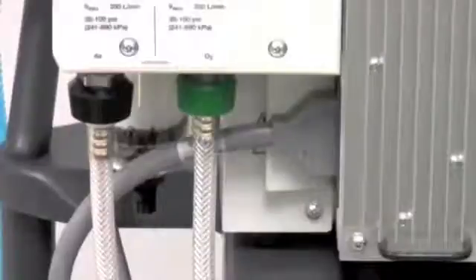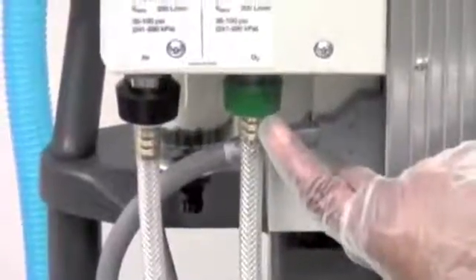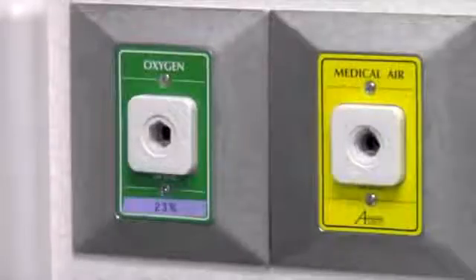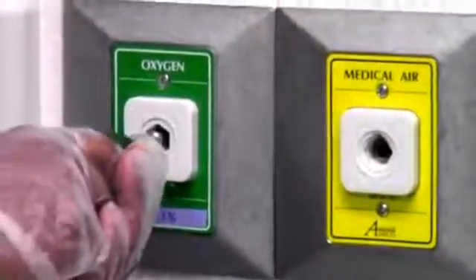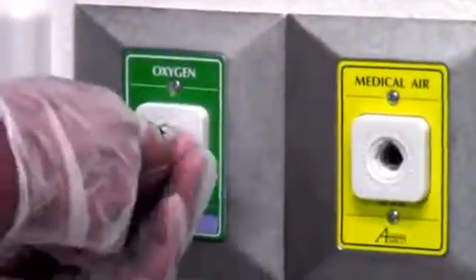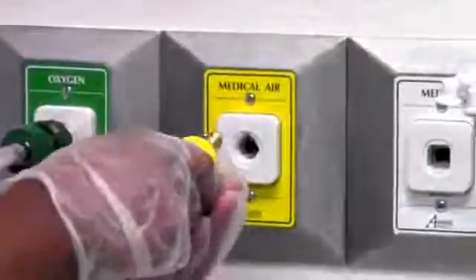You will now connect air and oxygen supplies to the ventilator. Connect the oxygen hose from the oxygen inlet connector to cylinder or wall supply. Connect only air to the air inlet and only oxygen to the oxygen inlet. Now connect the air hose from the inlet connector at the rear of the ventilator to the cylinder or wall supply — medical air.